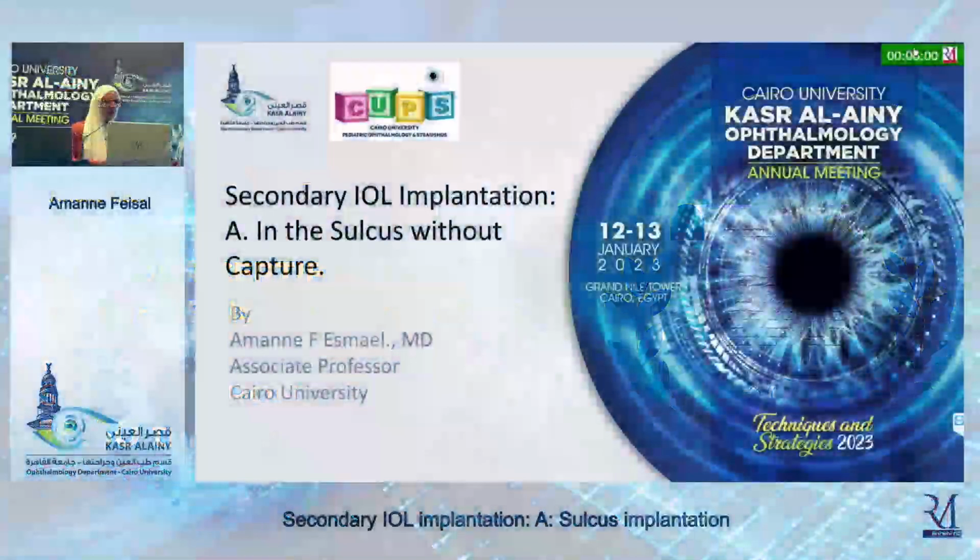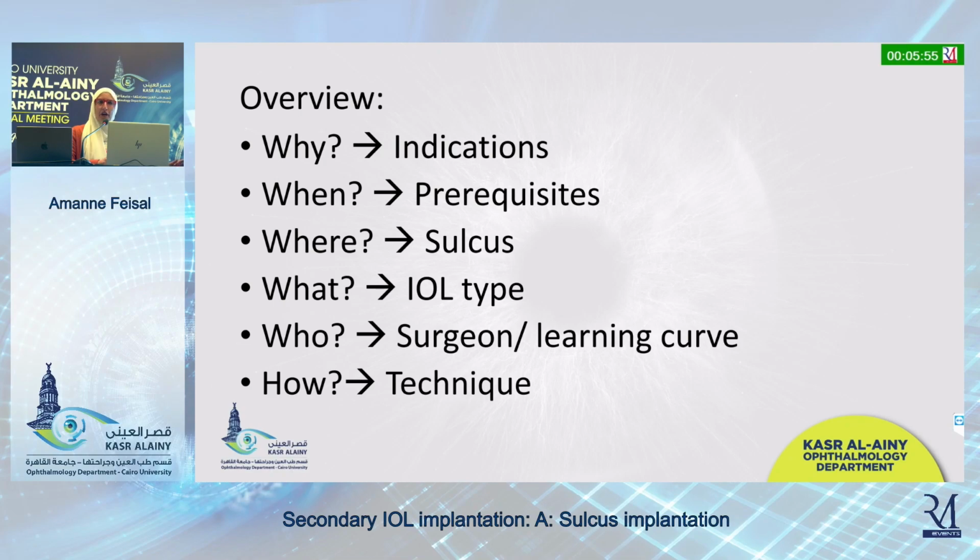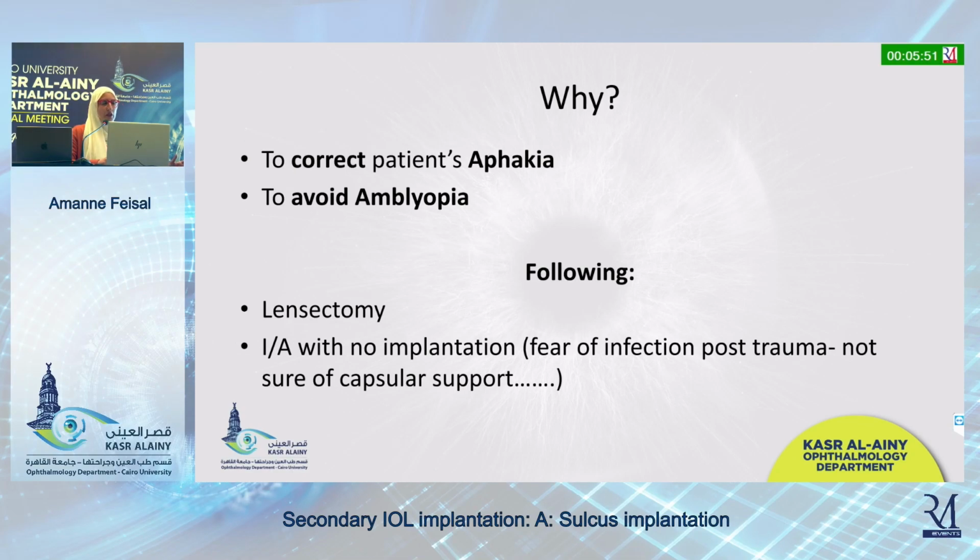So we're talking about secondary IOL implantation without capture. We're talking about the why and when and where and how. And we revert to secondary IOL implantation. We have an aphakic patient to correct their aphakia, obviously, and avoid amblyopia.